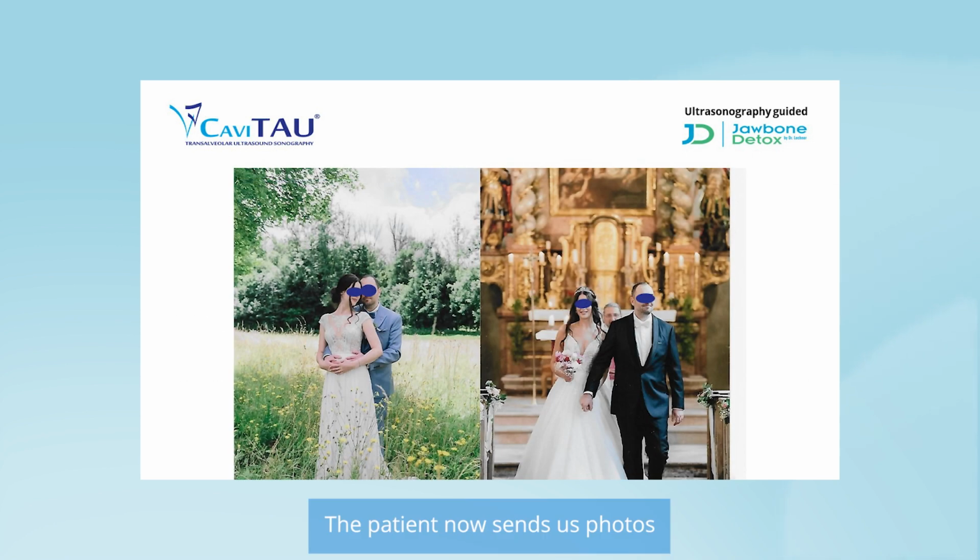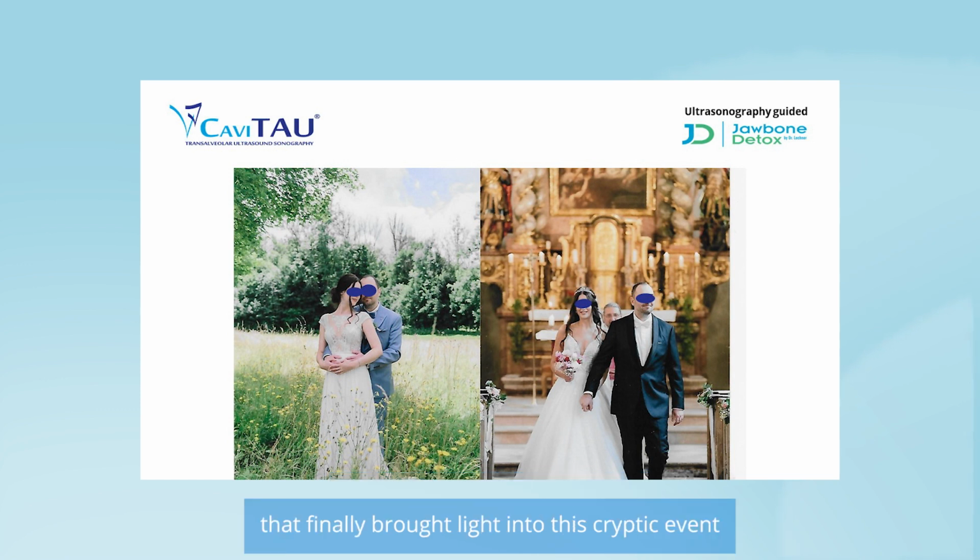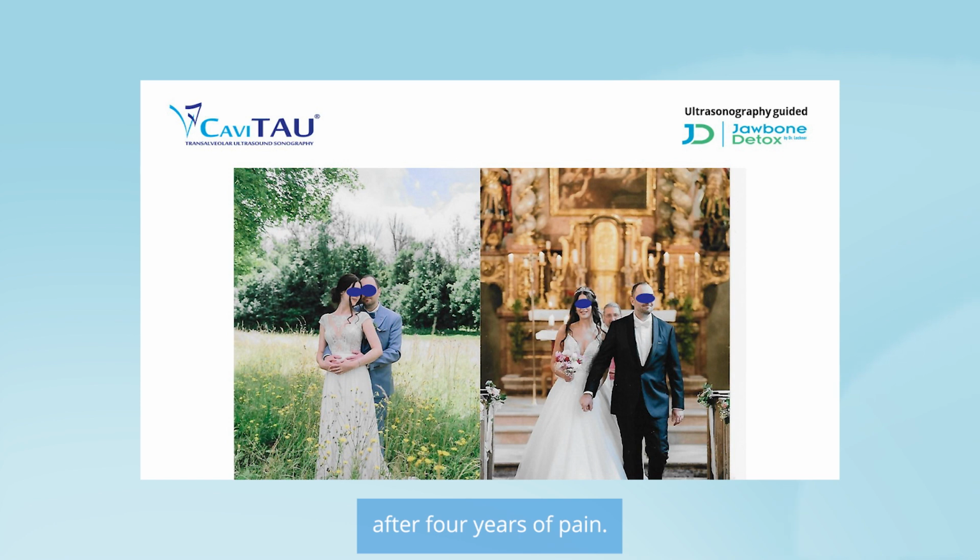The patient now sends us photos of the pain-free wedding and is infinitely grateful to us for the ultrasound diagnosis that finally brought light into this cryptic event after 4 years of pain.